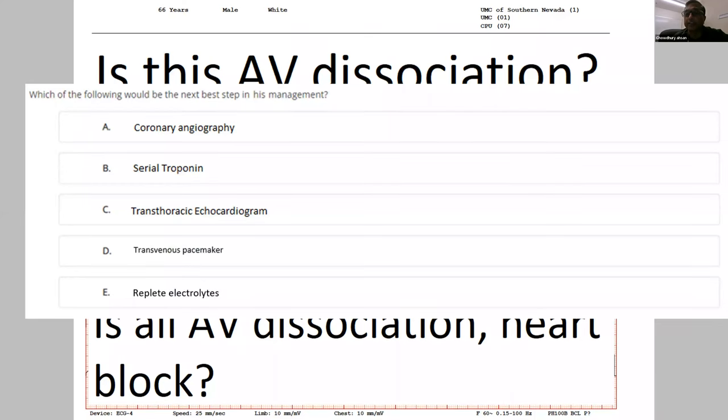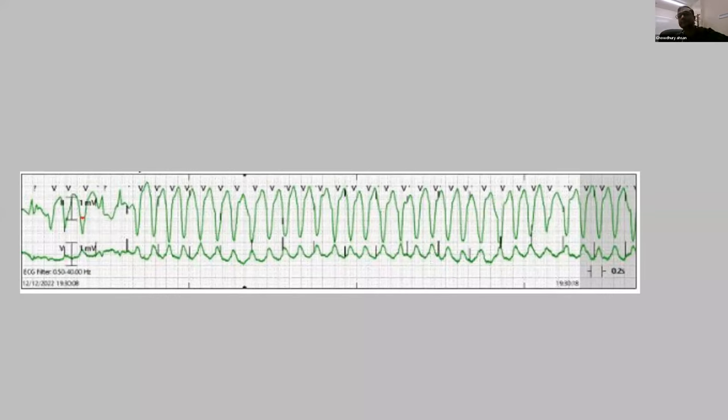While we are thinking, the patient does this. So this is actually a real thing, because they are thinking about pacemaker or not. And then the nurse called the fellow back. What is the magnesium level?